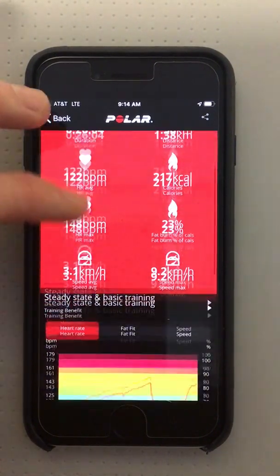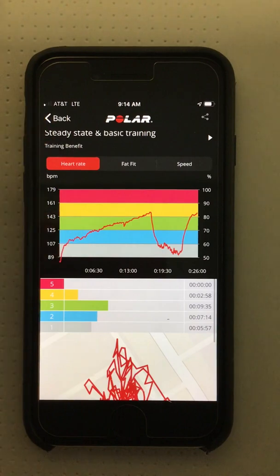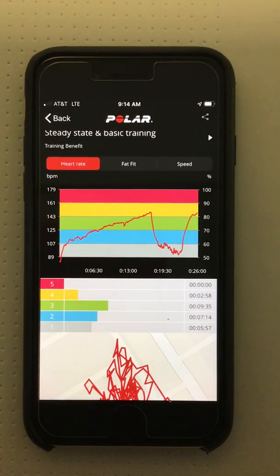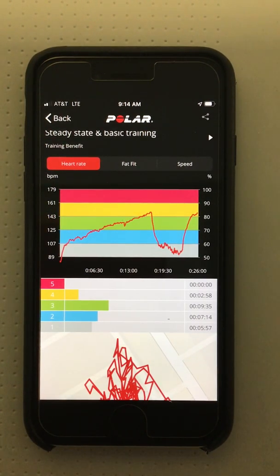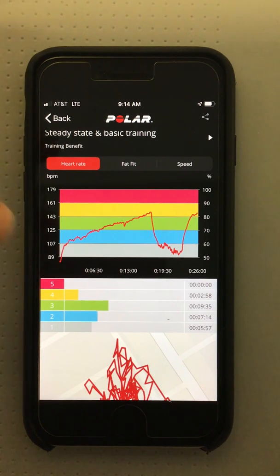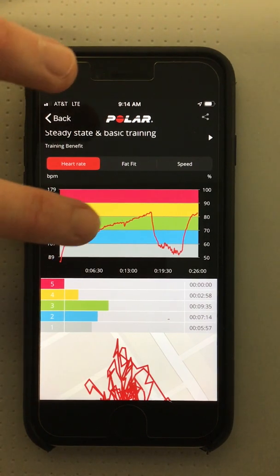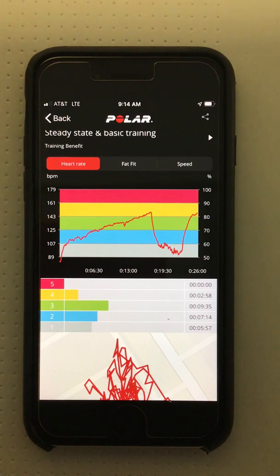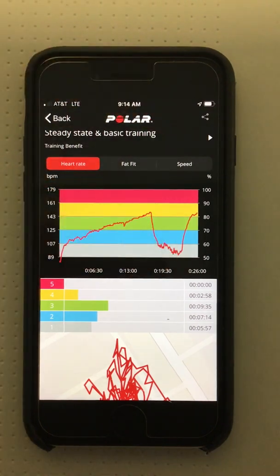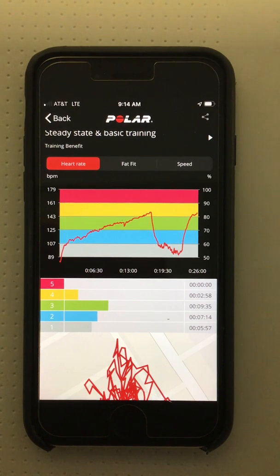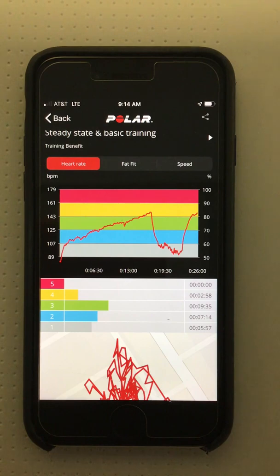Scrolling down to the graphs, the first line graph indicates how his heart rate changed throughout the training session. This patient walked continuously for 17 minutes with the heart rate climbing as the walking became more challenging. We took a short break at 17 minutes and resumed walking six minutes later with a very quick climb back up to the high intensity heart rate range over the final three minutes.